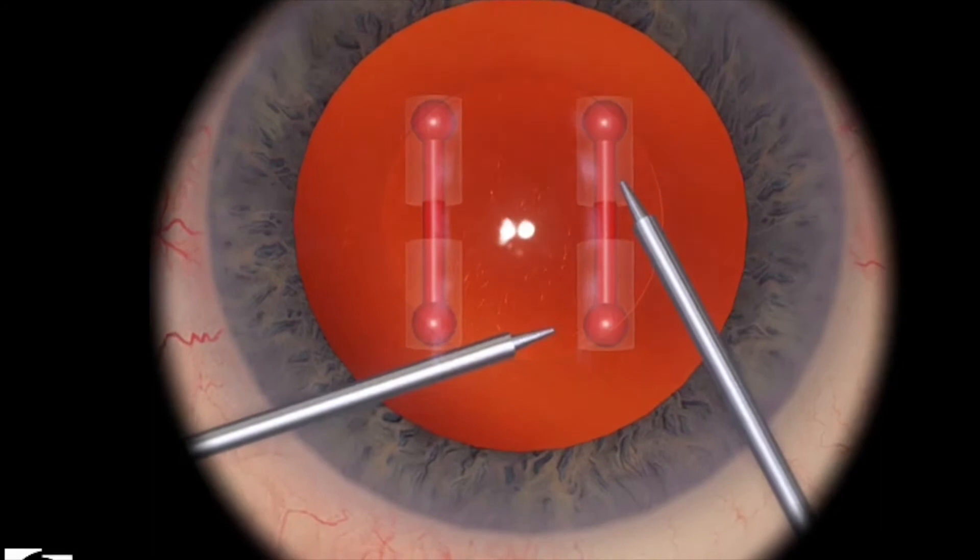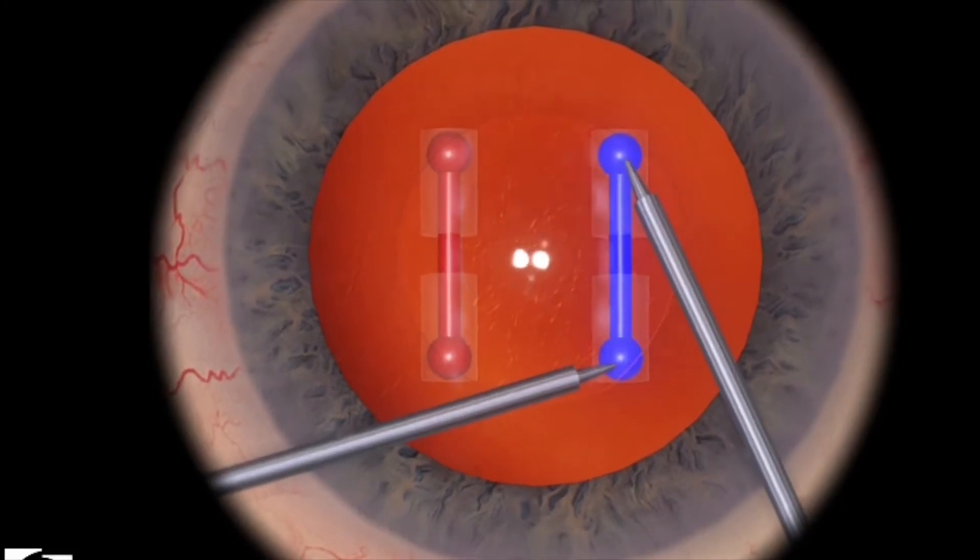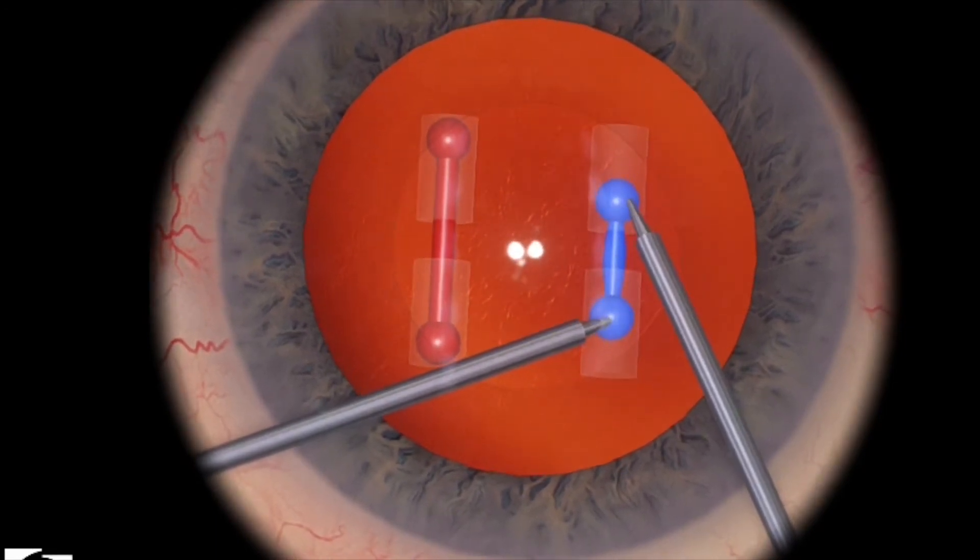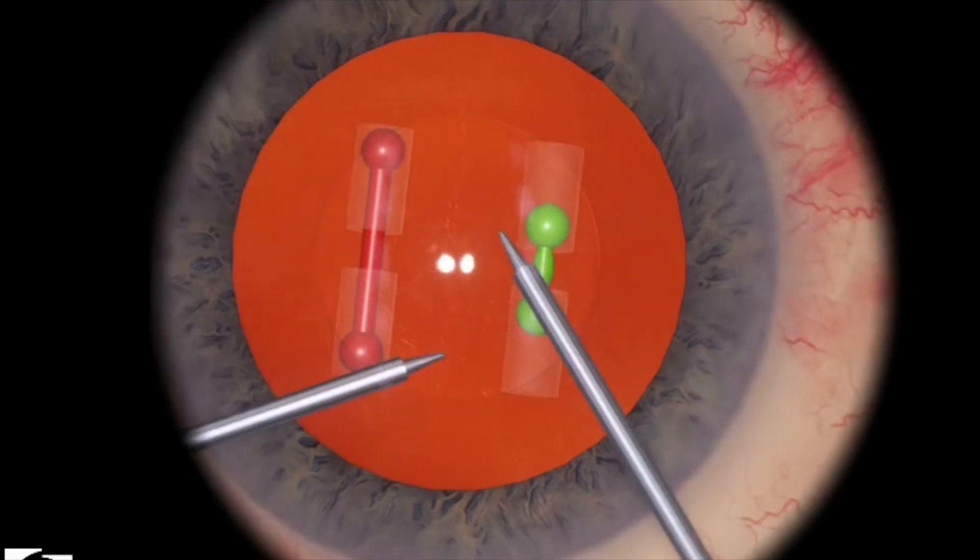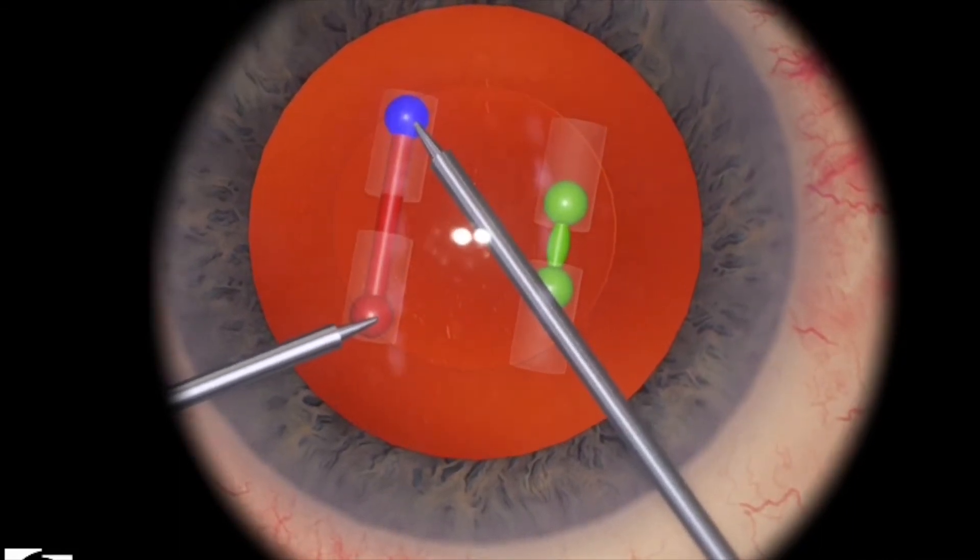Let's take a look at that one final time. Put the instruments deep inside the sphere, bring them slowly together, making sure that you're burying your tip deeper as you progress closer and closer to the center.